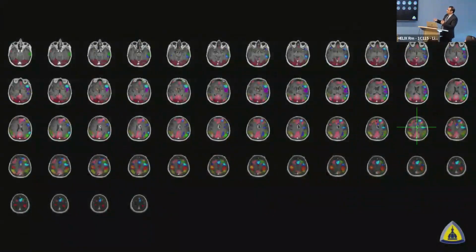And so this is a really great example of a case that we did early on and gave the neurosurgeons a lot of confidence in this tool, because I think that's critical. The first couple cases, if it works well, then they'll keep asking you, right? The first couple cases, if the outcome is bad, then they're going to say, no, I don't want to risk it because obviously patient care is most important. So here was a lesion that was in the anterior cingulate. And then the neurosurgeon said, hey, can you map out the supplementary motor area? Now that, it wasn't any of the core networks.